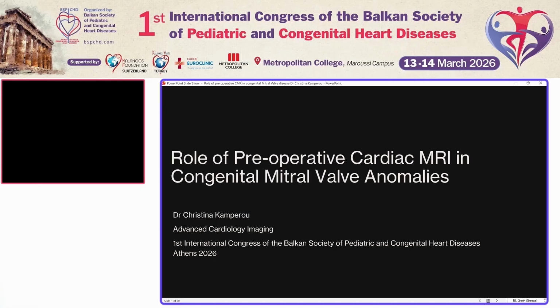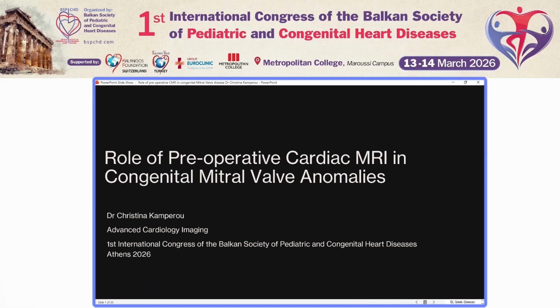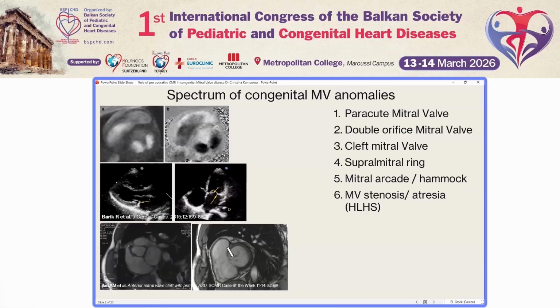I'm an imaging cardiologist. We're here today to comment on the role of preoperative cardiac MRI in congenital mitral valve anomalies. CMR has emerged as a fundamental tool for preoperative assessment in congenital mitral valve disease, particularly when echocardiographic data is insufficient or discordant with clinical findings.